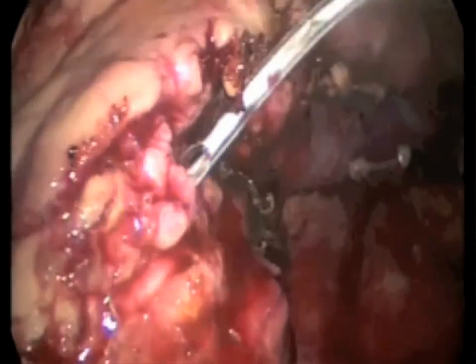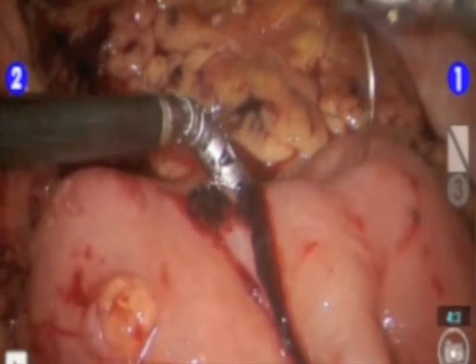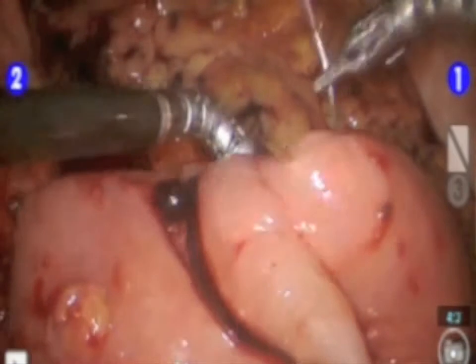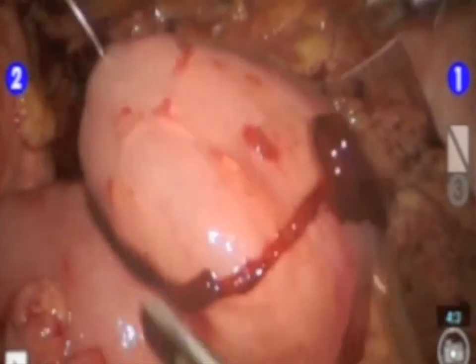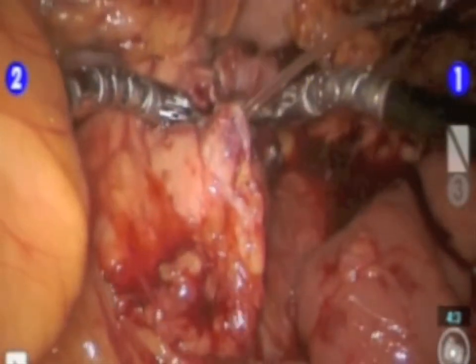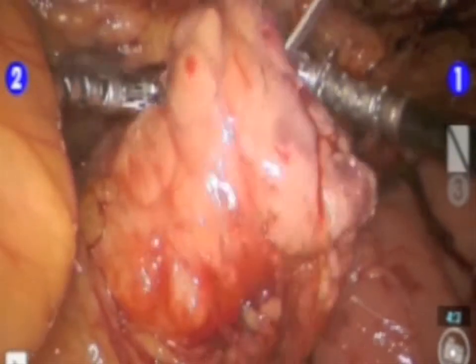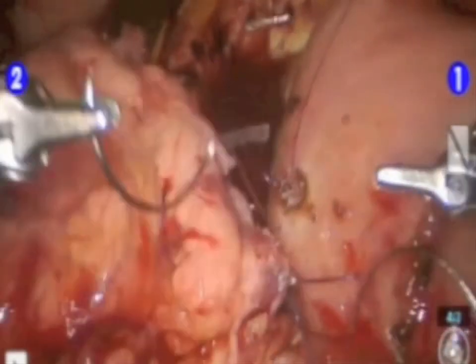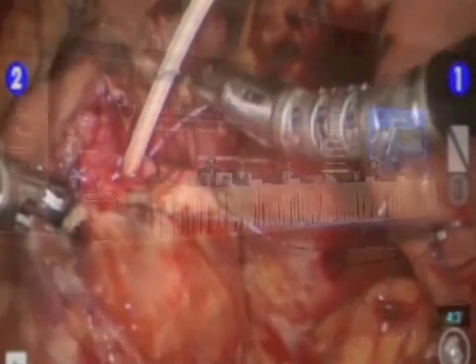This hybrid approach saves time and enables us to use the robot most expeditiously. If you're doing an operation very efficiently laparoscopically, you have to ask yourself whether it should be done robotically unless you can demonstrate really better outcomes using the robot. So with this realistic philosophy, we use the robot for the reconstructive part of the pancreatic procedure, such as performing the duct-to-mucosa anastomosis.